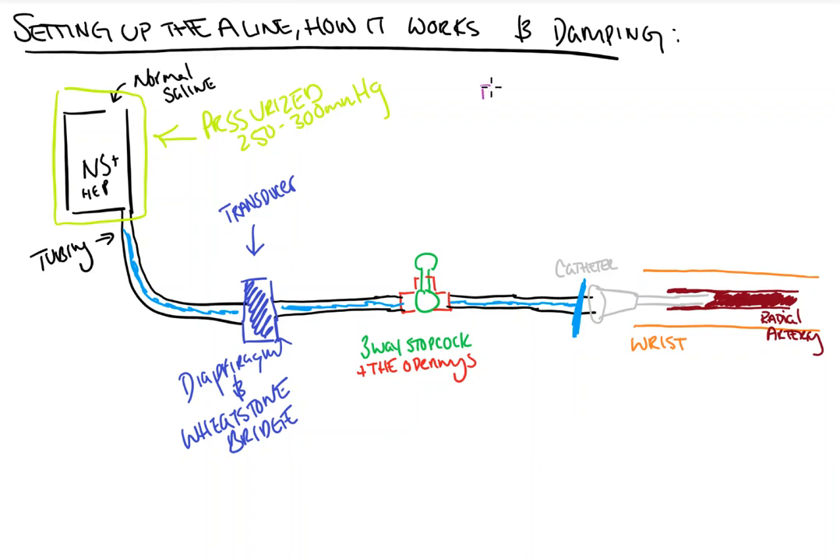Now the next thing we need to do, before hooking up to a patient, is we need to zero the system. To zero the system, we're going to turn this three-way stopcock so that instead of facing up that way, it's facing this way, closing off the line to the patient, making it so that the transducer is now open to the air at 760 millimeters of mercury.